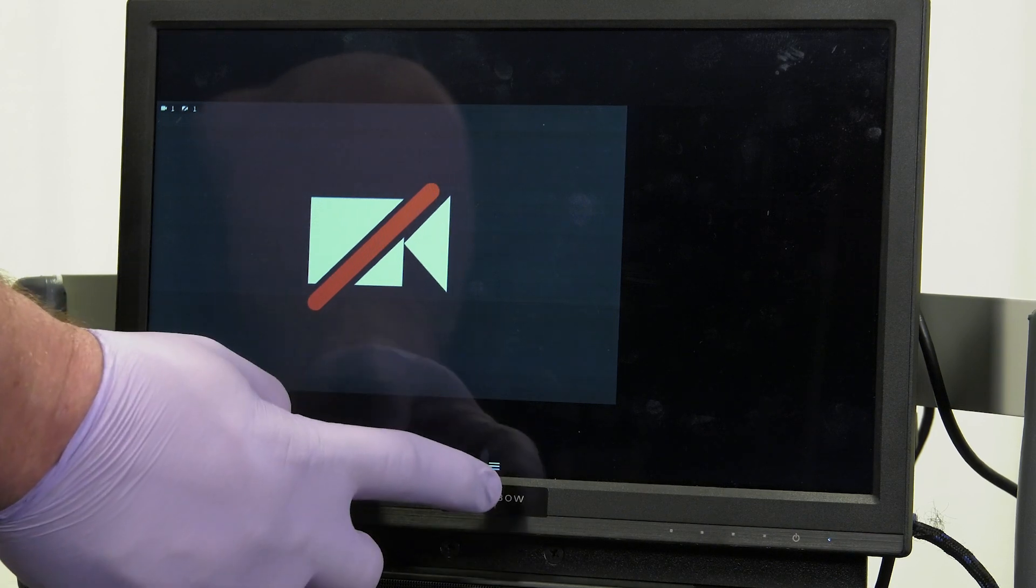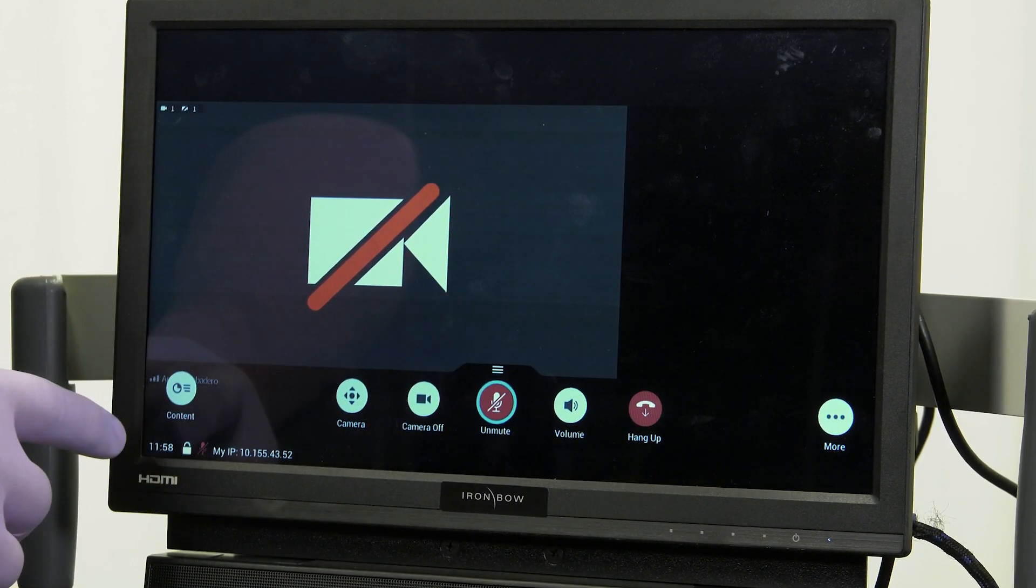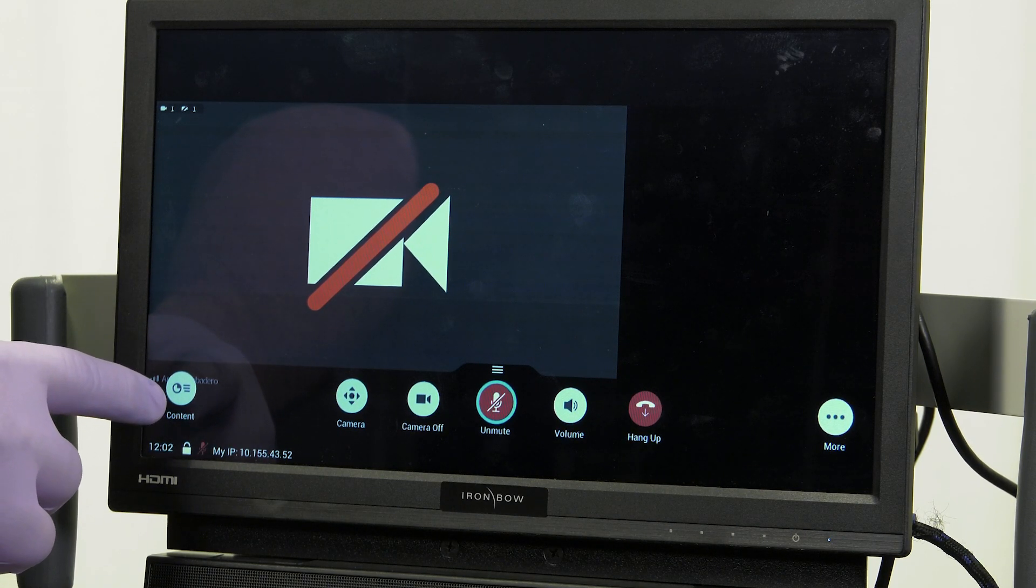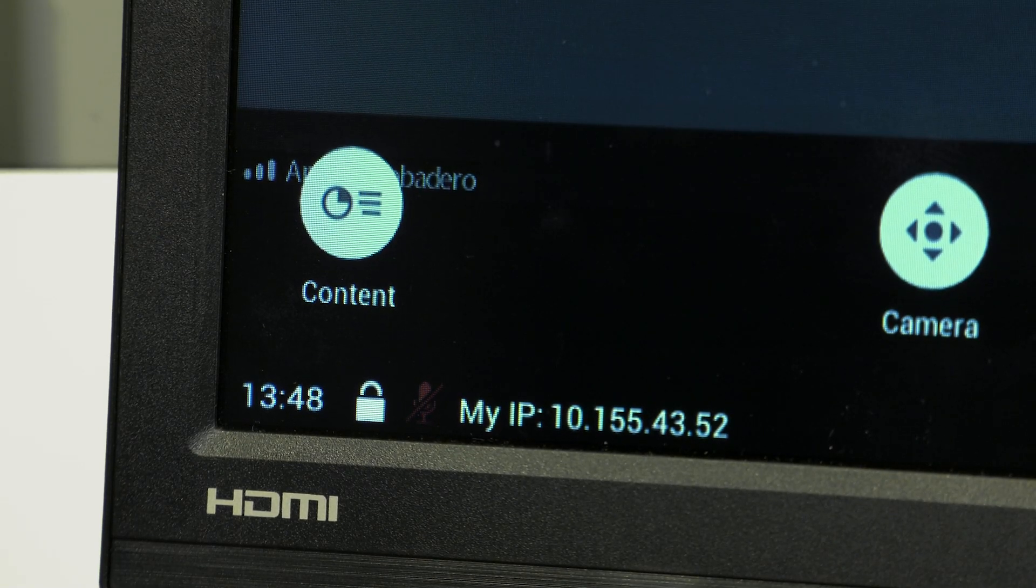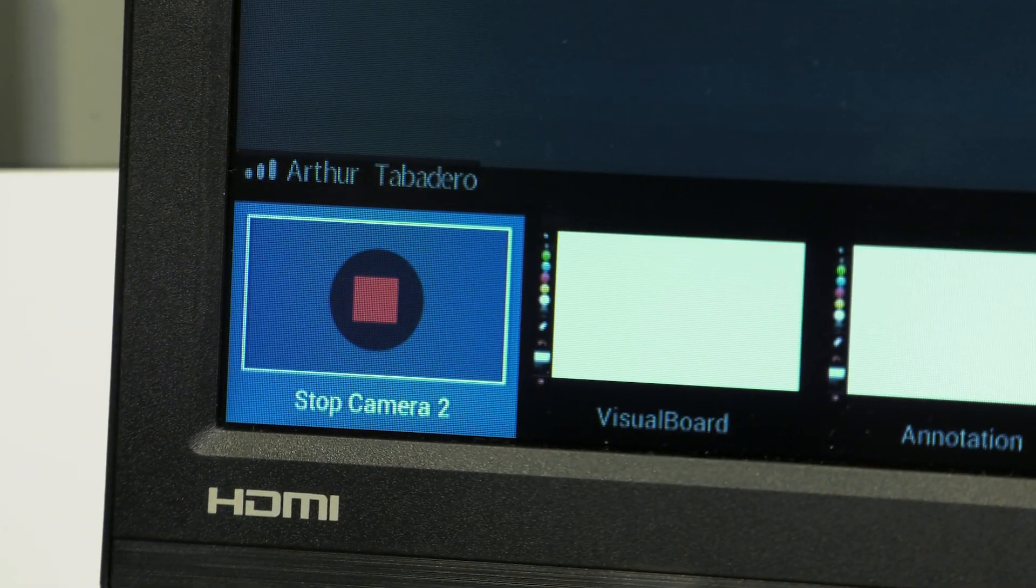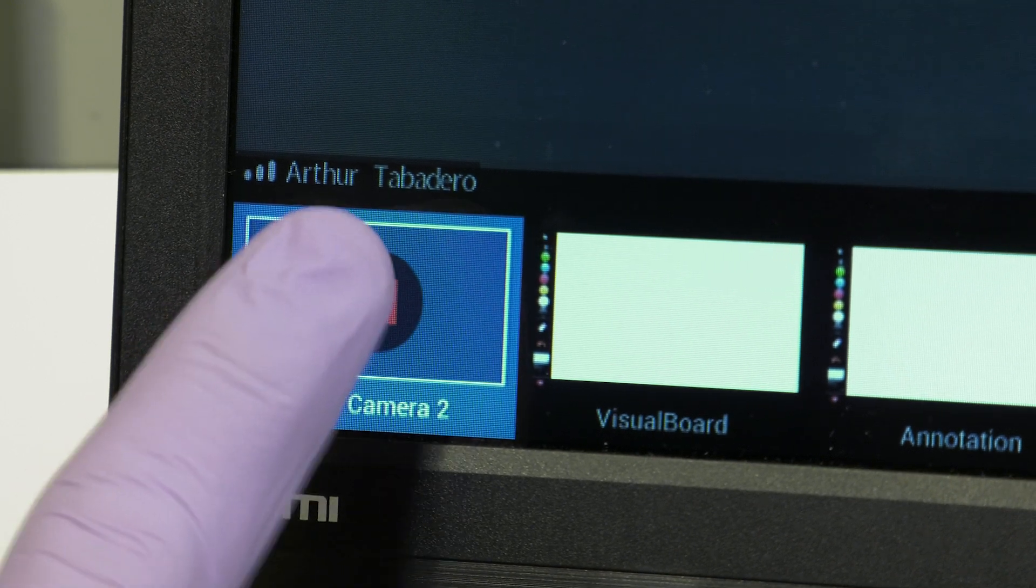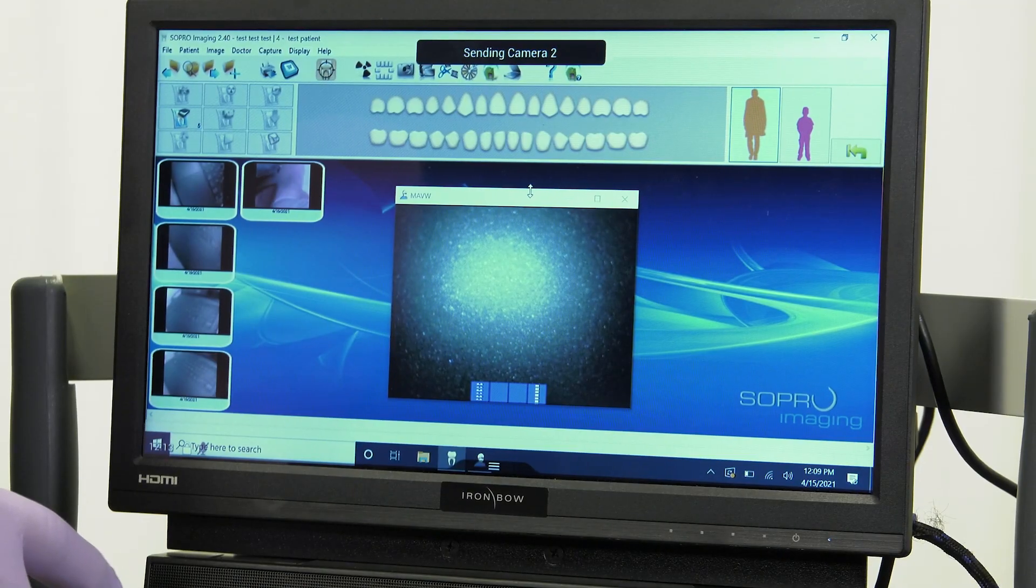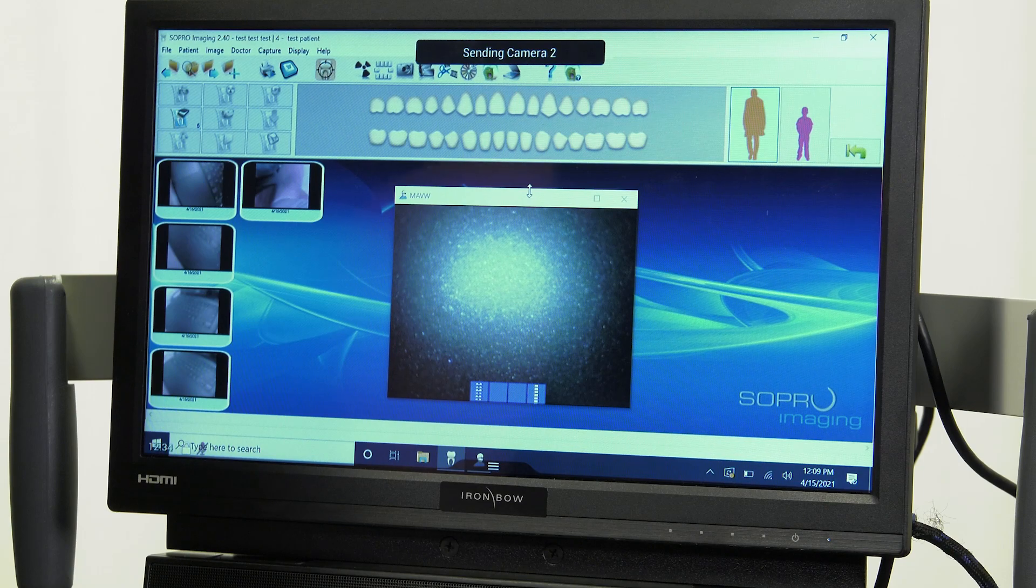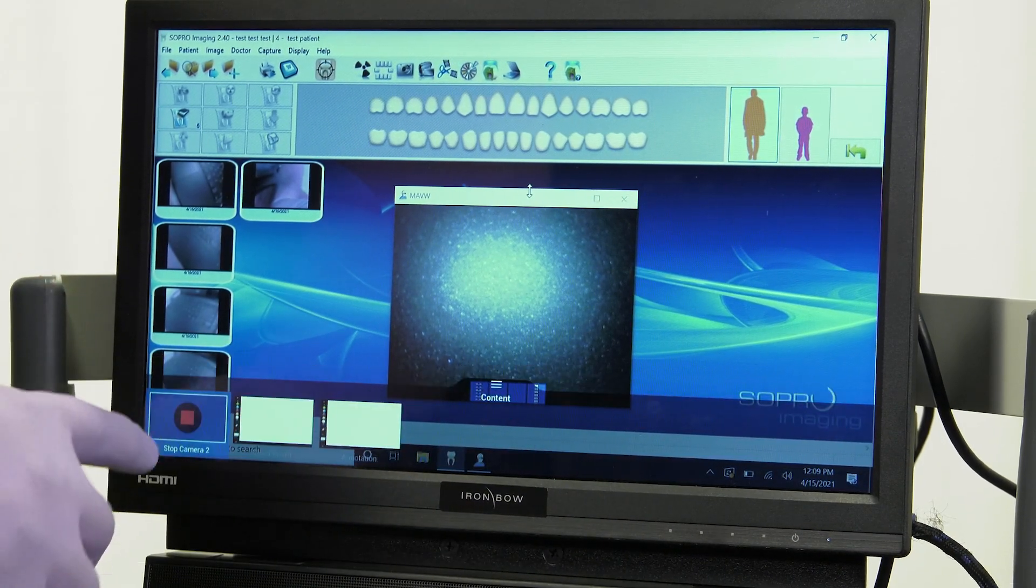Users can choose to share their device's screen during a Zoom call by clicking or tapping the Share Screen button. From the Teledentistry cart, this can be accessed via the Video Controls menu by tapping on the screen during a Zoom call. Note that the button to share the screen is labeled as Content. When Content is tapped, a list of inputs that can be displayed will appear. Tap on the appropriate input to display. To stop displaying the content, simply tap the Stop Content button on the screen.